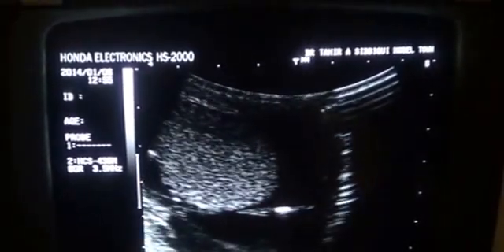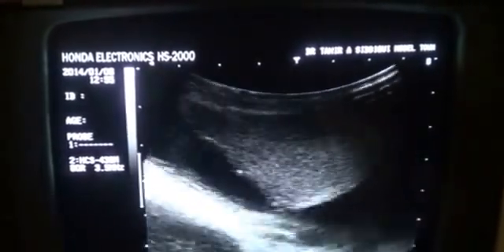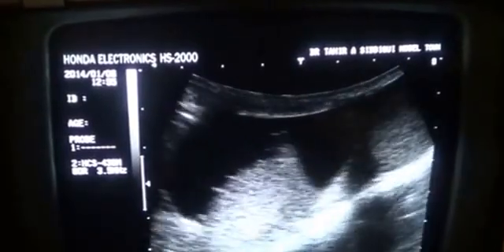This is a thick septa, and it also contains an echogenic particle within it which is not shadowing. Peritesticular echogenicities are quite visible. This is the transverse section of the right testis, where you can see multiple marginal calcifications.